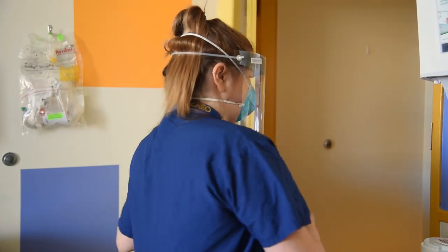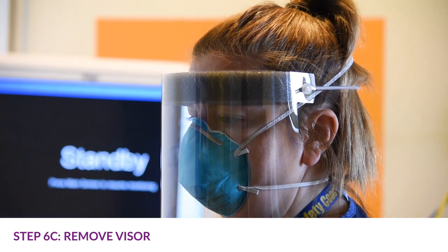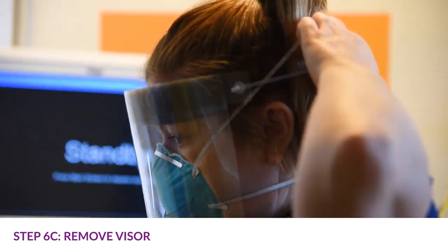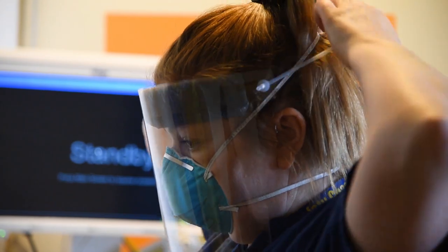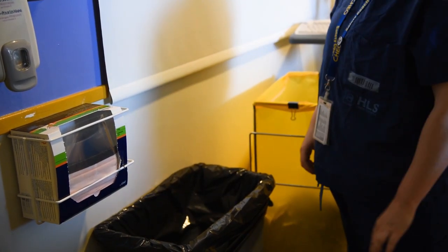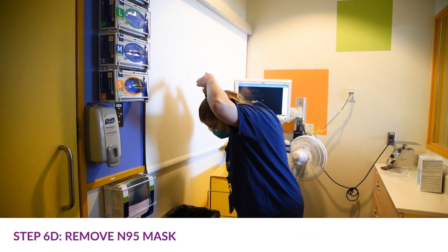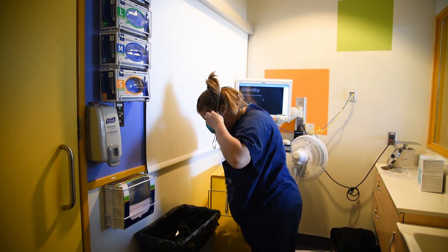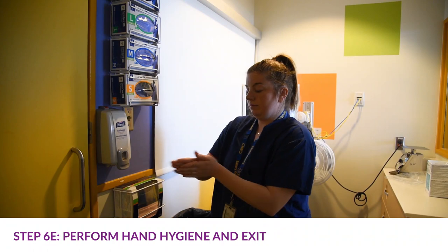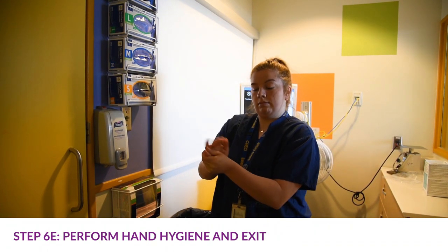If you're wearing an N95 mask with a visor, you must exit the patient room before removing the mask. Perform hand hygiene and handle the visor only by the headband or ear pieces. Carefully pull away from the face and put reusable items in the appropriate area for cleaning; put disposable items in the garbage. Bend forward slightly and carefully remove the mask from your face by touching only the ties or elastic bands — start with the bottom tie, then remove the top tie. Perform hand hygiene a final time before exiting the ante room.